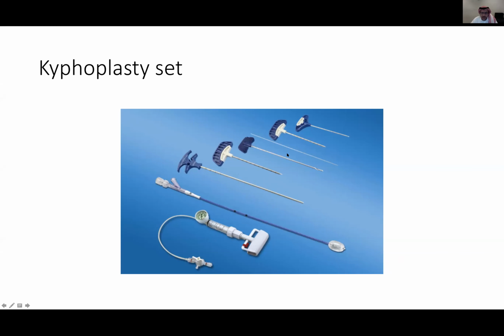One advice I give to my colleagues: when you can, when you just enter the vertebra, if you can take a sample. There is usually a bone sample tool in the kit that you can take, because you never know if it is really osteoporotic, traumatic, or could even be malignancy. If you can, it will be a good additive thing since you are in the vertebra.